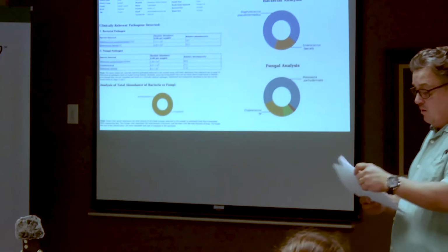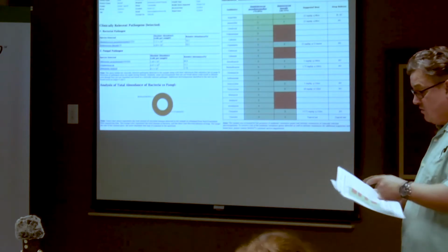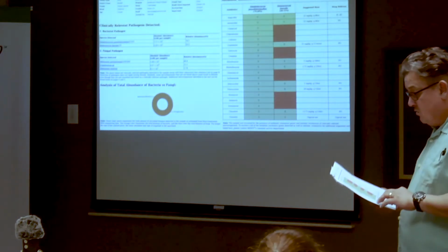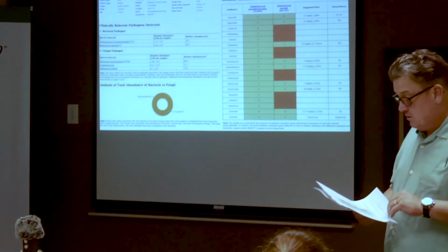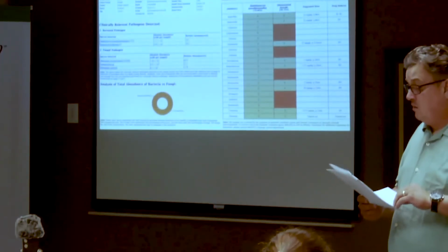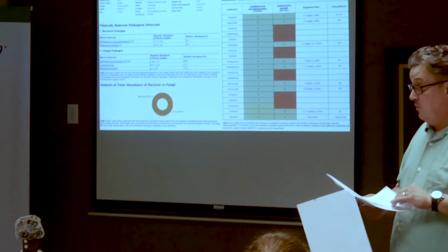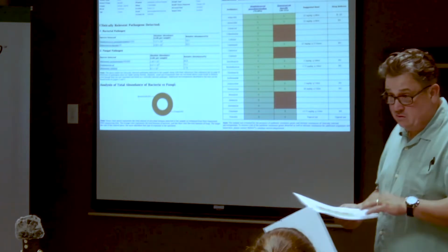The second one was the antibiotic sensitivities, or genetic resistance. As you can see, my Simplicef wasn't working on that Enterococcus. So I changed up my treatment and treated that dog hard for 3 weeks with marbofloxacin. When was this done? I can't remember exactly, I think it was in March. I haven't seen the dog back at all. I called her today before we came in. The dog's still asymptomatic.